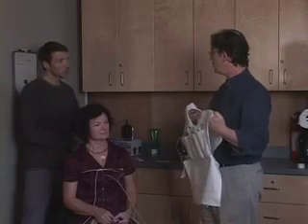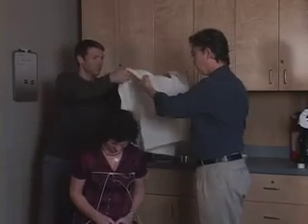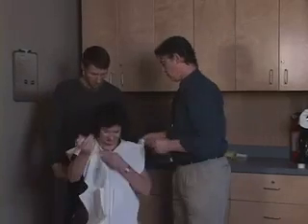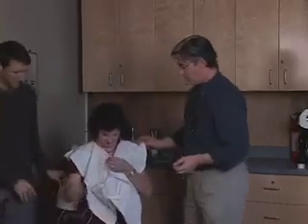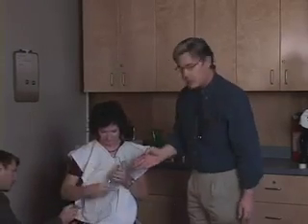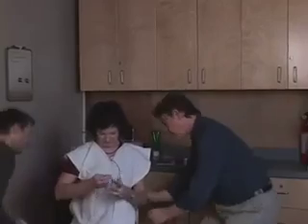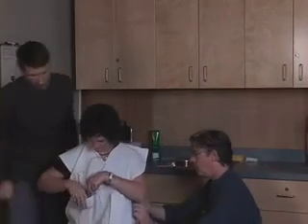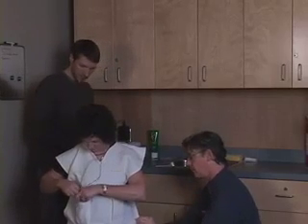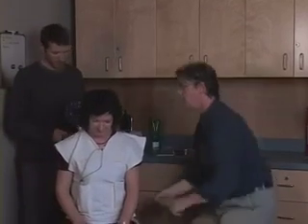So Ken, if we should start here by asking Kate to just bend forward. Thank you very much. And we'll place the vest. And that's coming through now. And we can roll this up, and the excess cords here will go into one of these frontal pockets so that they're not dangling or in the way. And the vest is secured by Velcro straps, so it fits comfortably and snugly.